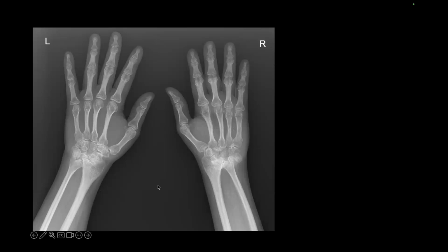Whereas in this case, this is an example of advanced disease. We can see there's a SLAC deformity with scapholunate collapse, and there's ligament disruptions with erosions and deformity to the carpus.